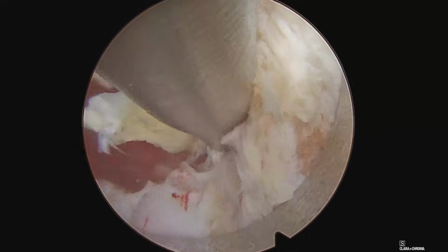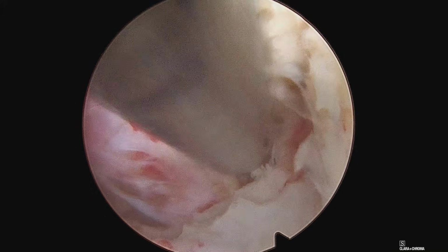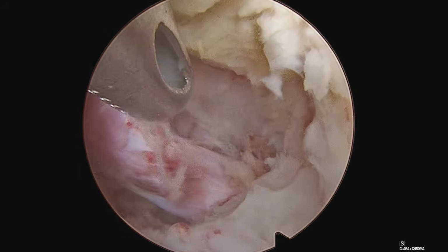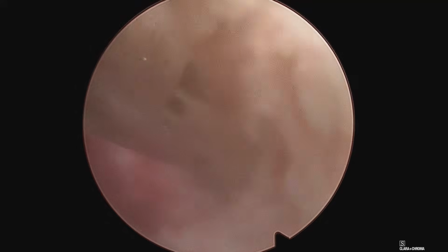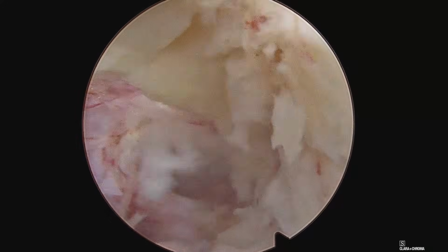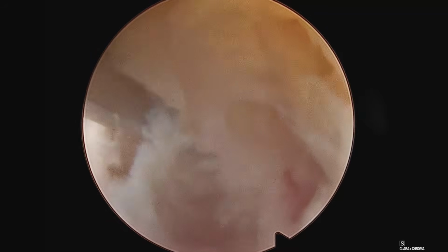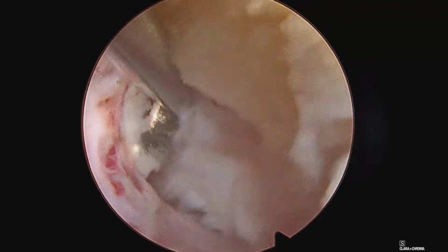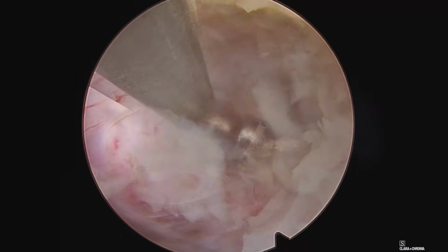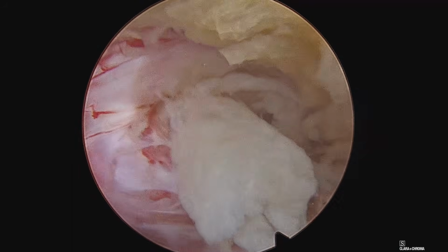So here ligament and the part of lower lamina is excised and sequestrated fragments are being excised from the axilla. Here you can appreciate the sequestrated fragments between the axilla and theca. A 90-degree instrument is being used to gradually pull up the sequestrated caudally migrated fragments.